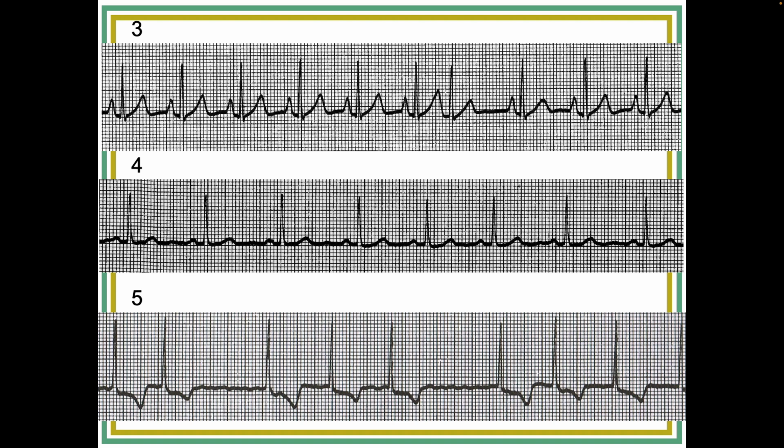Okay. And in what way is it irregular? Regularly irregular. You see a pattern? I think so. If it was a longer strip, maybe not. If it was a longer strip, I could tell. Yeah, I agree with that. It looks like it's going to be regularly irregular to me. Irregular or regular? Sorry. Irregular. So you think it's going to be like 2 short and 1 long, something like that? No, it's irregular. We love patterns, that's the problem. We always want to see patterns. Go with irregularly irregular.